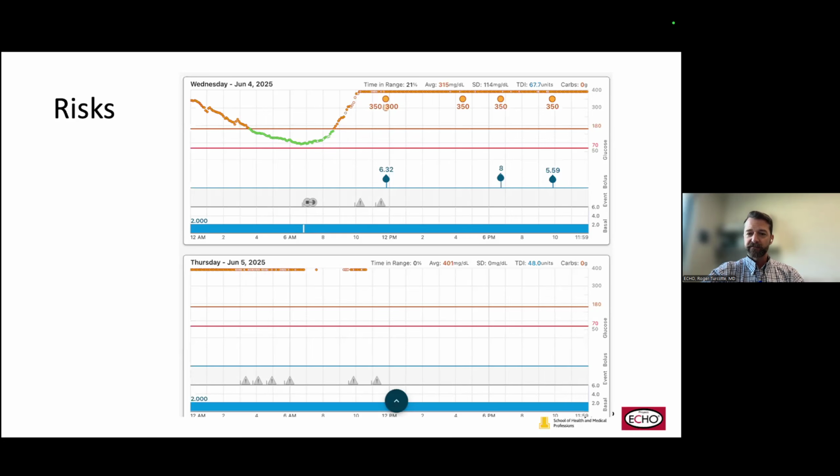And when that happens, their blood sugar will rise in a linear fashion, and it will be very high, and that is a dangerous situation. It does occur regularly. Patients will have site failures, and they just have to recognize them, and they can fix it, or they can give an injection.